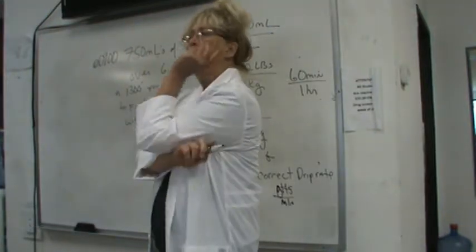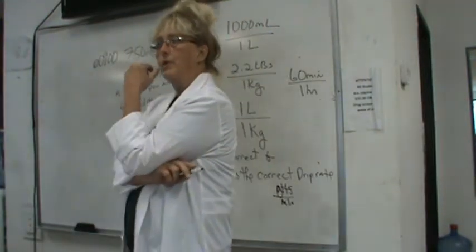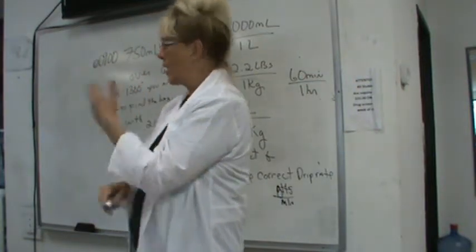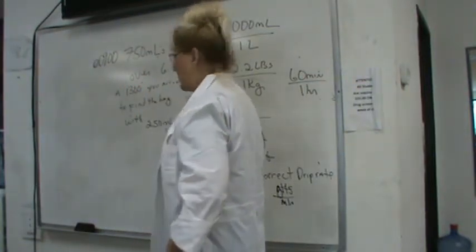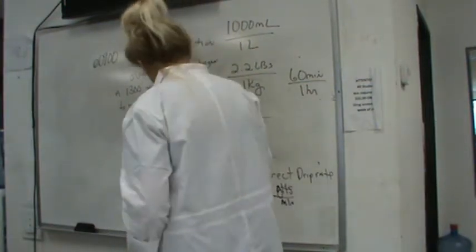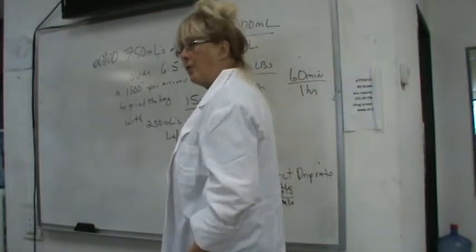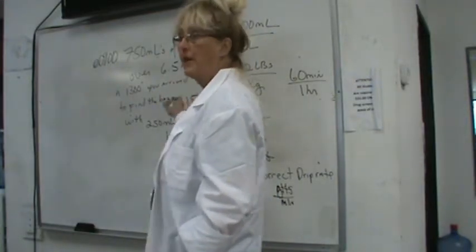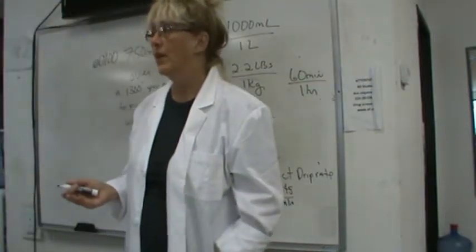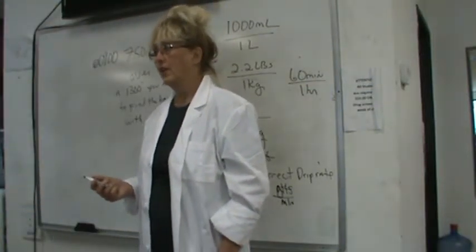So you ask yourself, they still have 2 hours, right? Your job is to check that 250 mLs should be left, or if the drip rate's not correct, we have to correct it so that they'll be done by what? By 3 o'clock, correct? It says 6.5, that's an hour and a half.